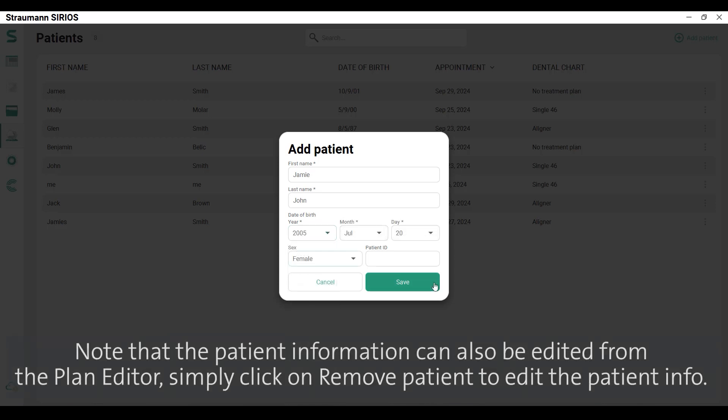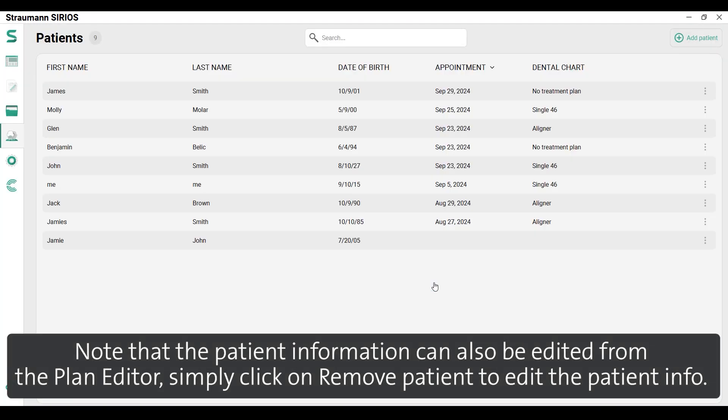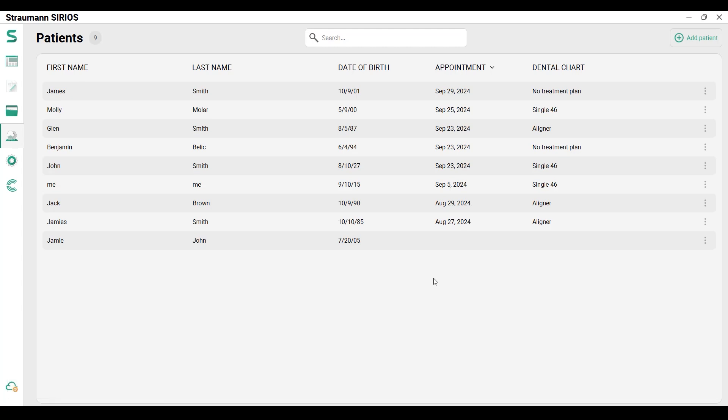Note that the patient information can also be edited from the plan editor. Simply click on remove patient to edit the patient info.